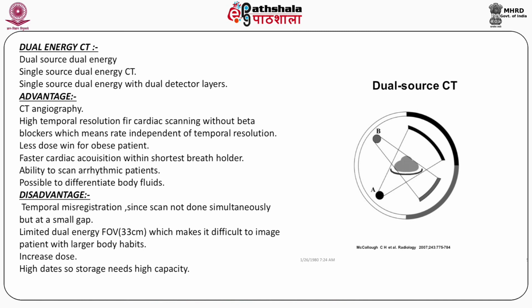possible to differentiate body fluid, but the disadvantage is temporal misregistration, since the scans are not done simultaneously but with a small gap. Limited dual energy field of view like 33 centimeters, which makes it difficult to image patients with a larger body, and moreover doses are slightly more as compared to single slice CT scanner.